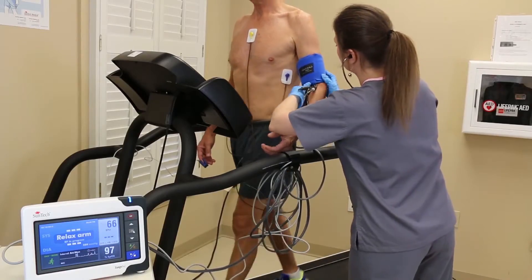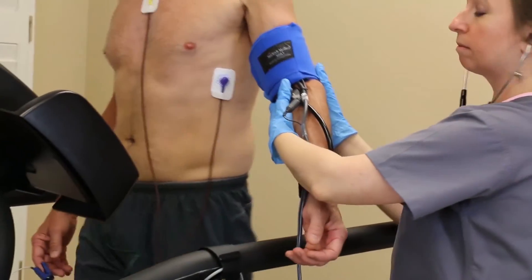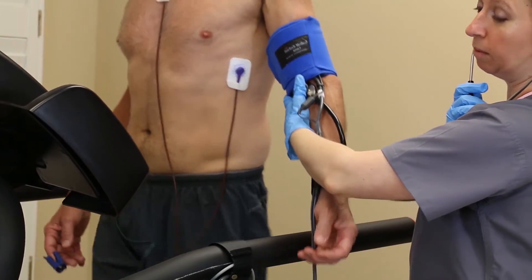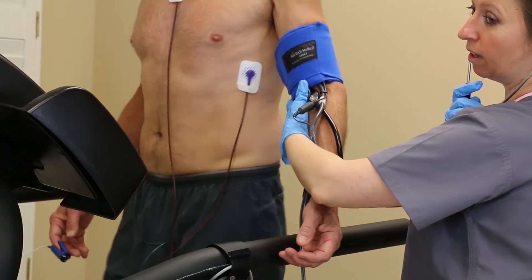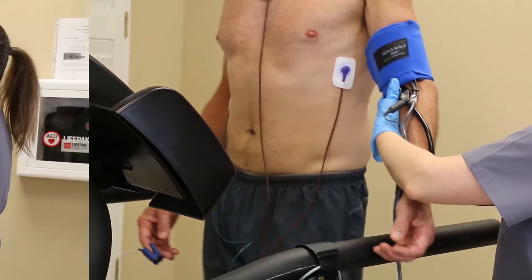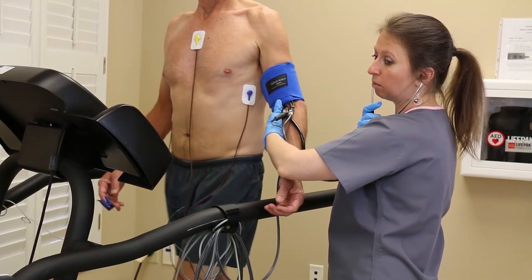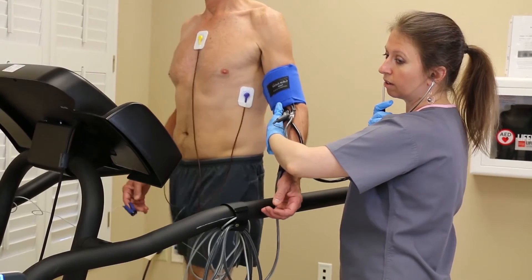To properly verify readings, we recommend that you place a stethoscope below the Orbit K cuff at the crook of the elbow and press the Start button on the Tango M2. Check the monitor screen for the data you need to ensure that both readings are being taken simultaneously and have the same deflation rate. Utilizing the same cuff and taking readings from the same arm with the same deflation time will ensure you eliminate variability.